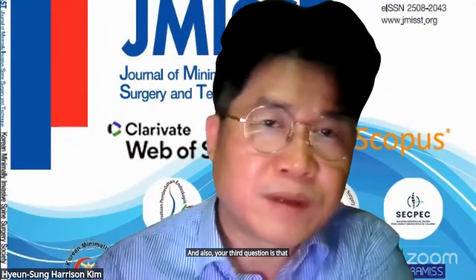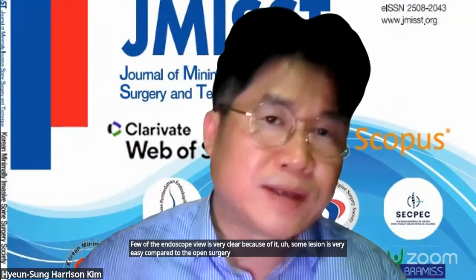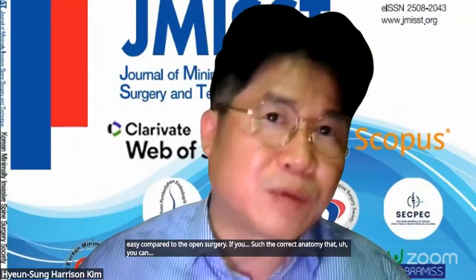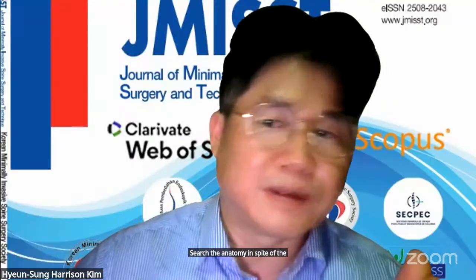And your third question is related to revision, adhesion tissue management and dissection. That is also very easy in endoscopic lumbar interbody fusion, because the endoscopic view is very clear. Because of that, revision is very easy compared to open surgery. If you search for the correct anatomy, for example the bone structure, first, then you can very safely proceed, finding the anatomy in spite of the revision case.